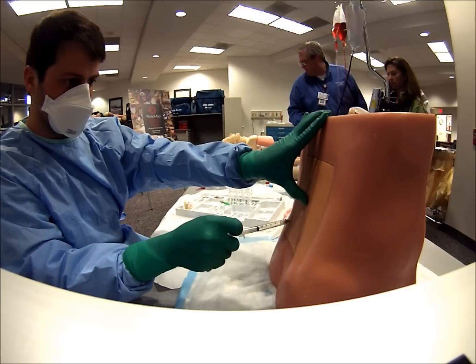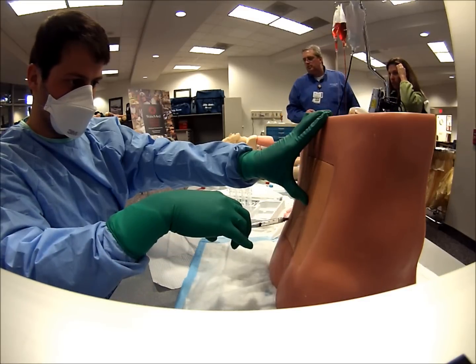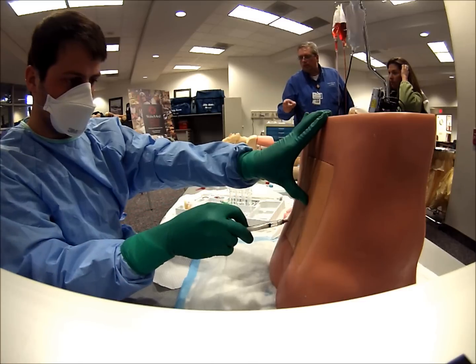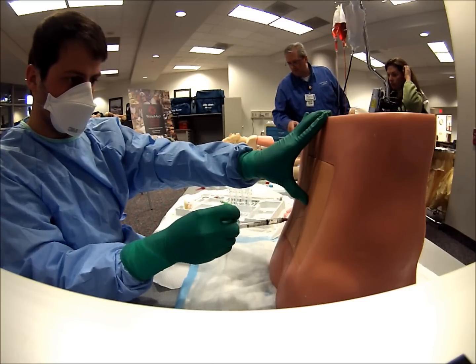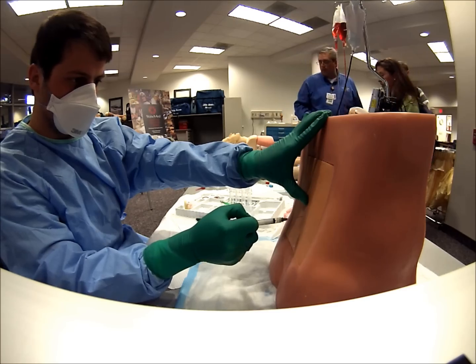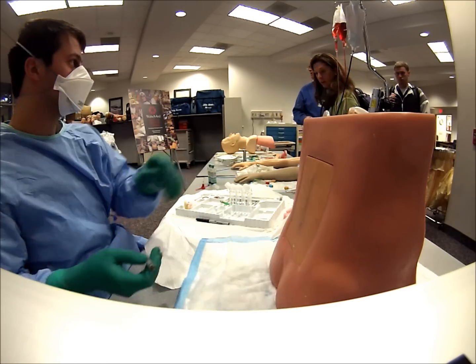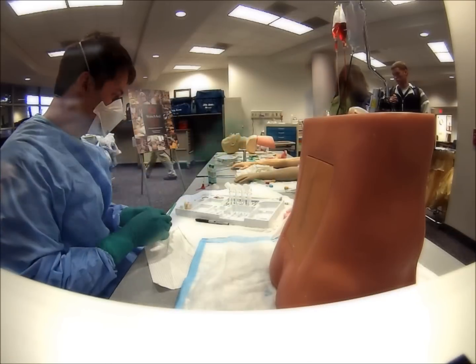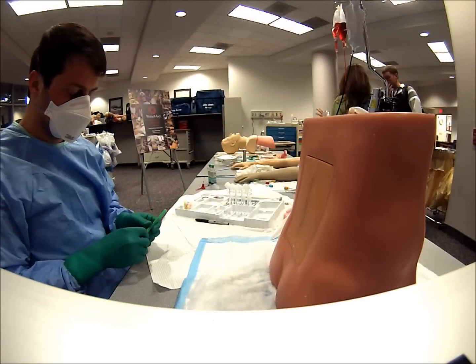Some practitioners like to provide a field block before providing their patient anesthesia, but instead we're going to inject the needle, aspirate to make sure you're not in any vessels or CSF, inject about a third of it, and do this three times while pulling out.